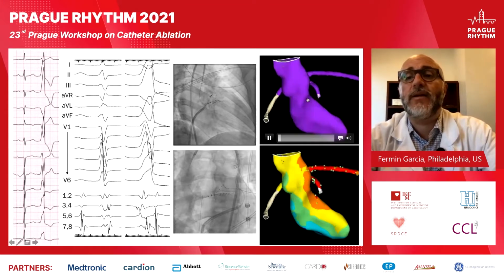This is not endocardial to epicardial. This is not subepicardial to intramural. This is intramural early, where this electrode sits, 1, 2 on the duodeca, and from there spreads out to the epi and the breakthrough to the endocardium.